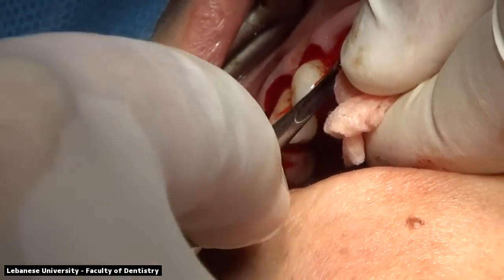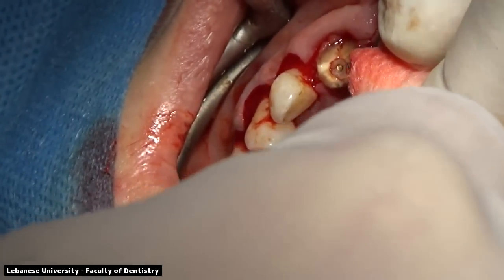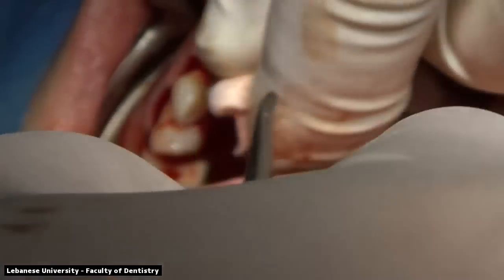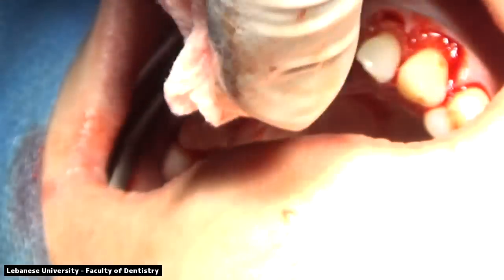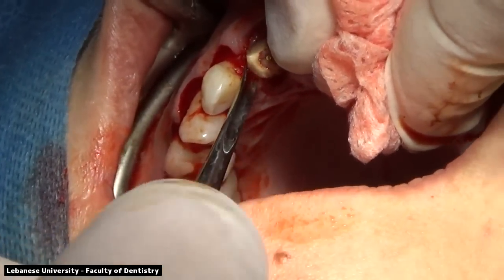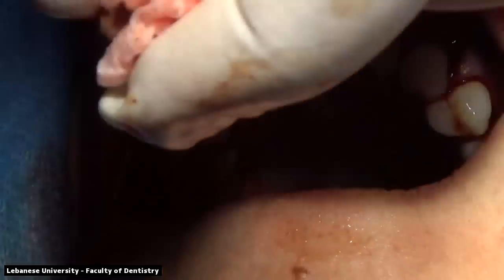But in this case, we can see that the roots are moving. We're using a straight elevator. So we can appreciate the movement of the root of the tooth, and the right central incisor has been removed.